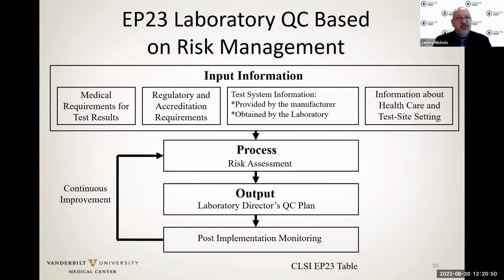To get started, we essentially take information about the test. What are the medical requirements for the test? What's the total allowable error or medical uncertainty about this test? How is the test going to be utilized, the result, by the clinician? What's the regulatory and accreditation requirements? Here in the United States, we're under CLIA.